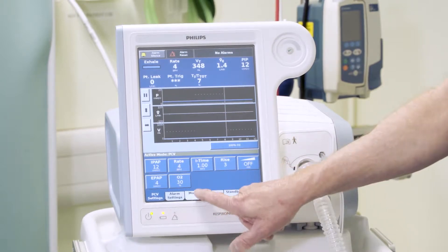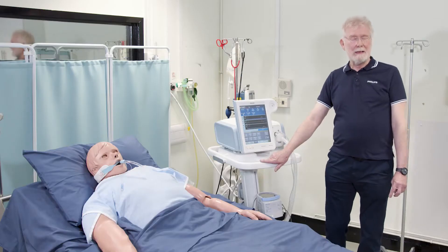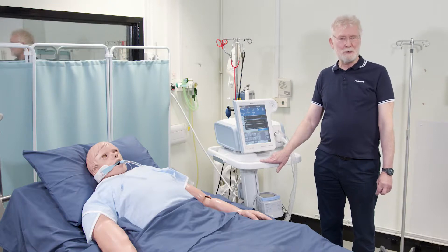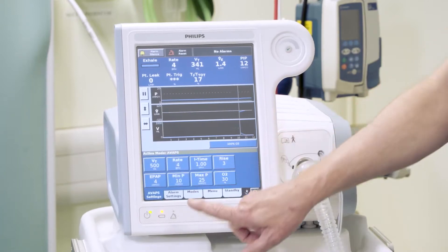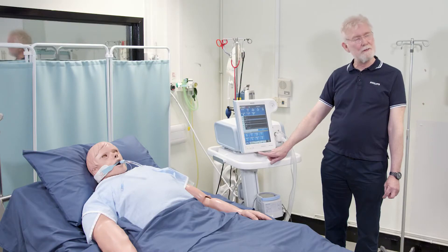It is also possible to use AVAPS mode invasively. AVAPS has a long acronym — Average Volume Assured Pressure Support. If I activate that, as with the previous mode, I can adjust the settings on this device.